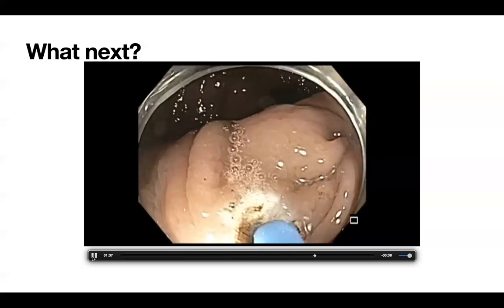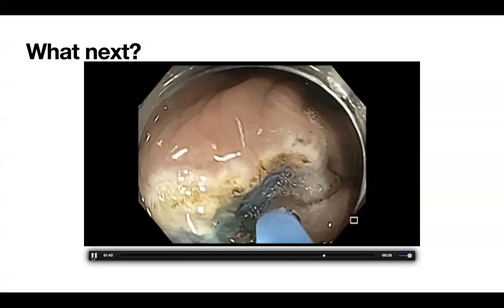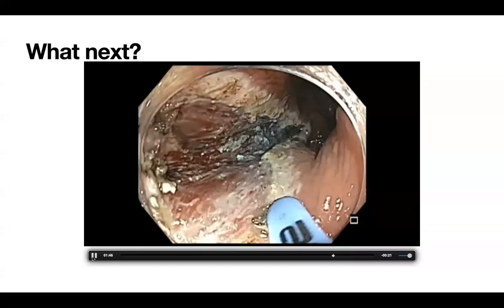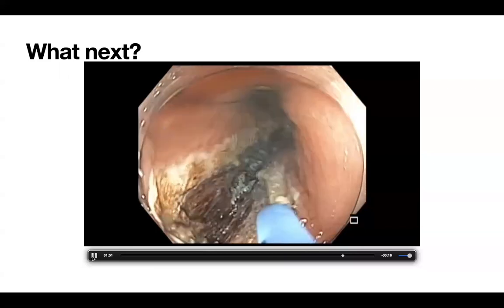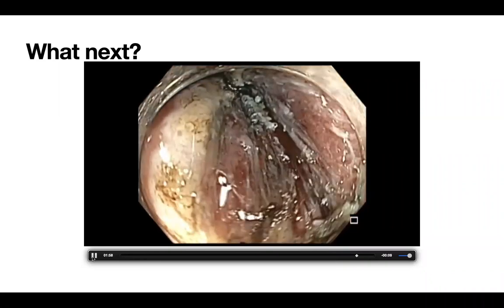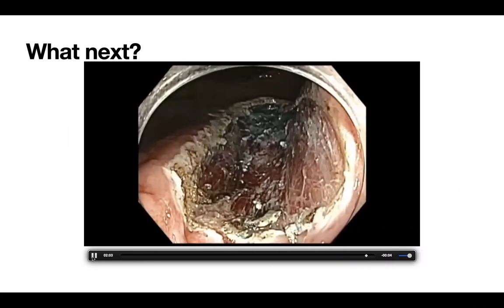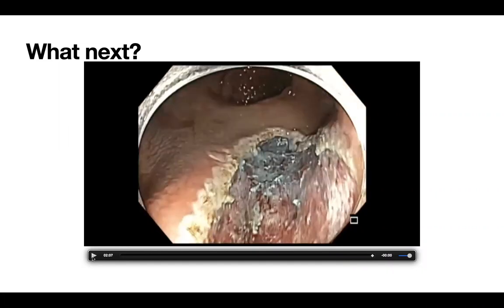And the question came was, let me ask everybody in the panel, starting with Sriram. Roy has already talked about it. What do you guys do right now? You see the lesion. Would you ablate those vessels or leave them open? Ablate it. That hurt, and it saved the patient from bleeding. Okay, you said that. Let me ask you, Sriram.